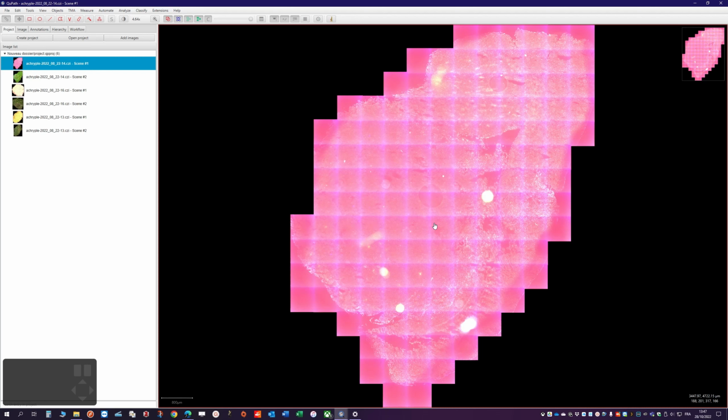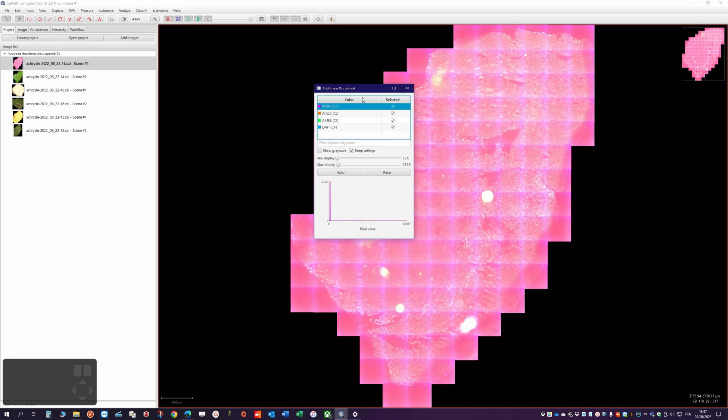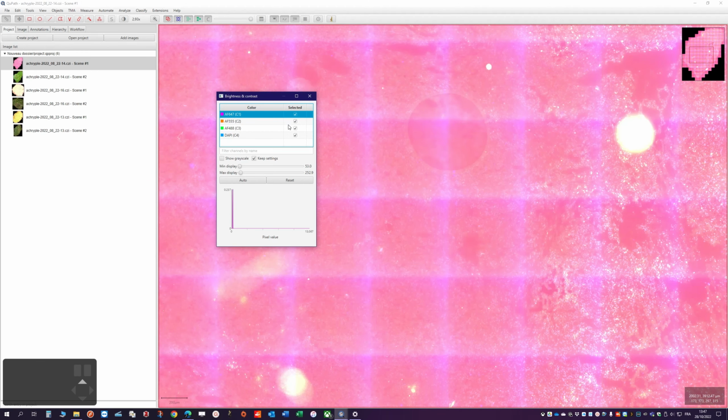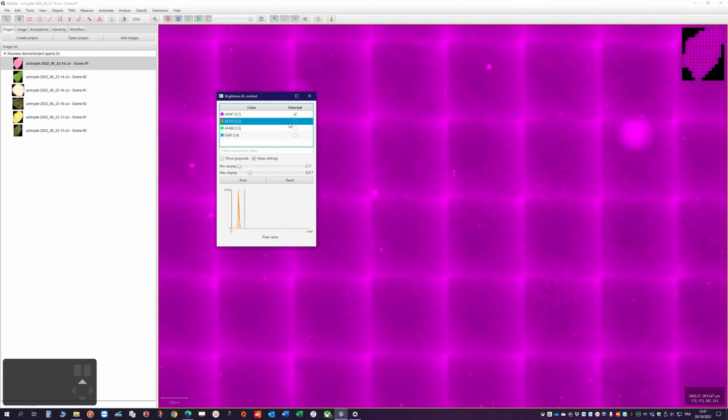the default display settings are not that well done, so let's do some quick adjustments here. So we will work one channel after the other. How should we proceed?